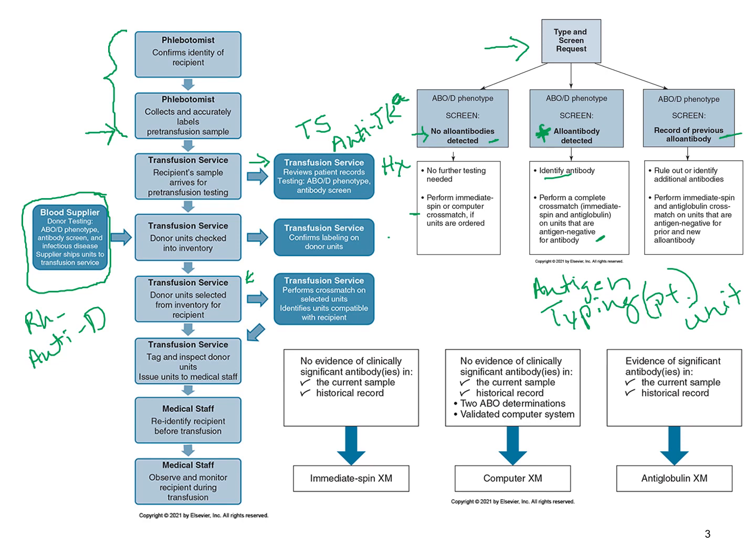Antigen typing our patient to make sure that they are antigen negative for that particular antibody is going to be your confirmation. If they are not negative, you need to do some investigation. Maybe they were previously transfused at another facility and you need to contact that facility and get that history. So that's what you're going to do if there is an antibody present. You're going to work it up, you're going to identify it, and you're going to honor it.